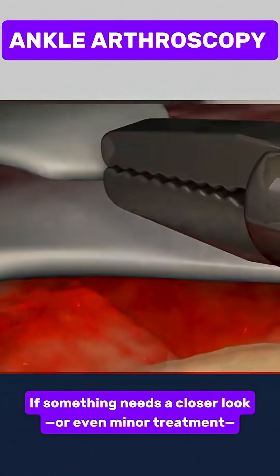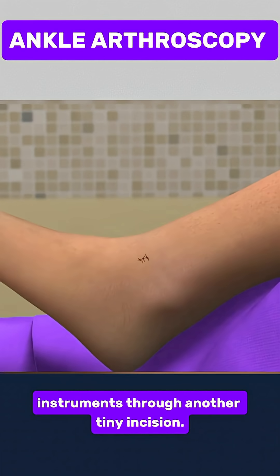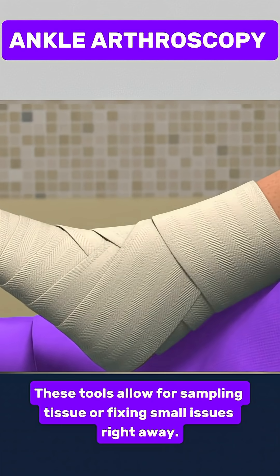If something needs a closer look or even minor treatment, the surgeon can insert delicate instruments through another tiny incision. These tools allow for sampling tissue or fixing small issues right away.